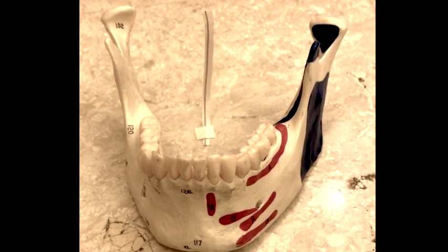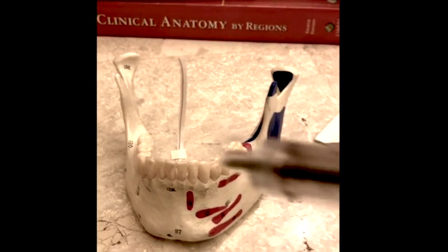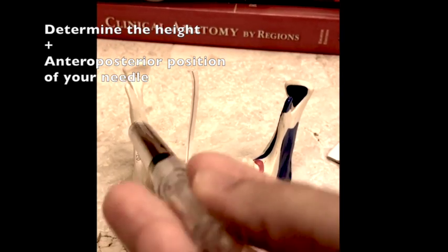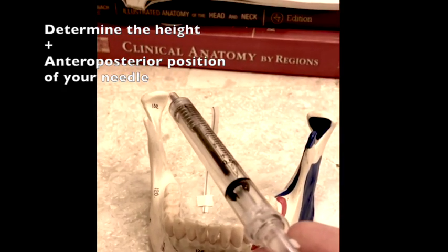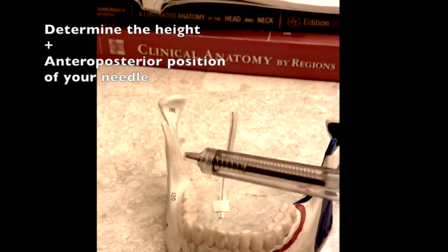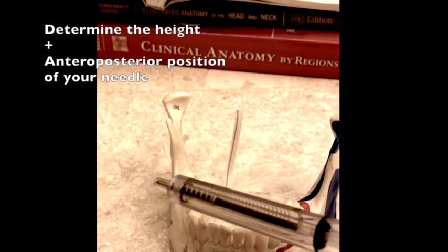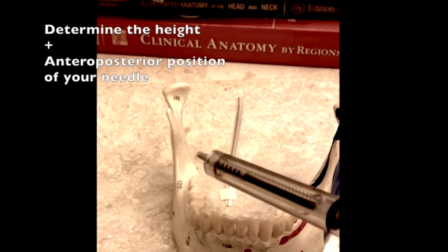Now that you know your aim and your anatomical landmarks — both hard tissue and soft tissue — the technique involves two things: first, the height, meaning exactly where vertically you want to give the anesthesia; and second, the anteroposterior position — do you want to give it here, there, or in that direction?